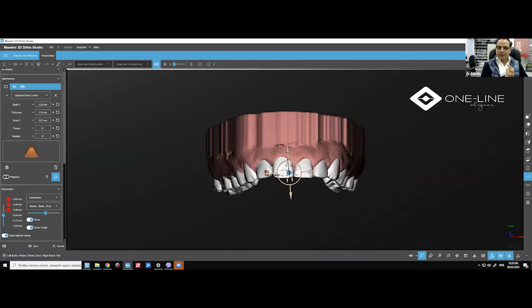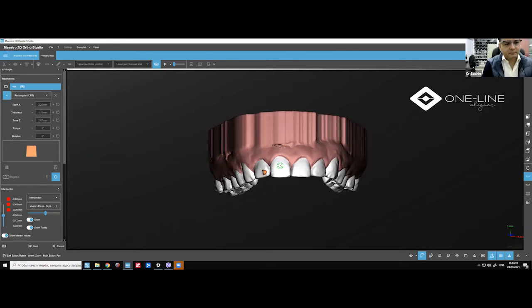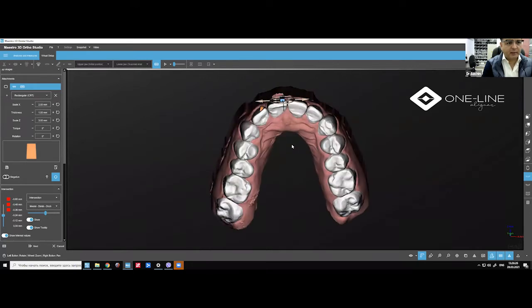And we can do negative attachments on the mesial side. Sometimes if a patient does not agree, normally I have pliers to do activations on the aligner, but you can also do a negative attachment in this case. You need a big one, because actually the kind of attachment that you will get in the mouth will be a lot less.